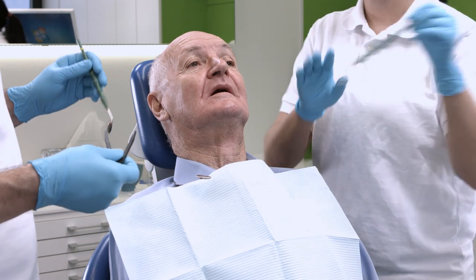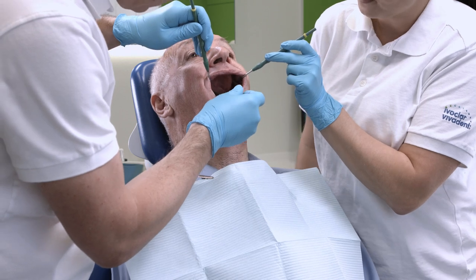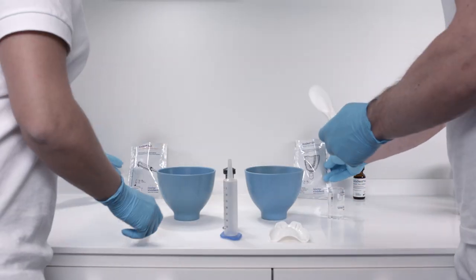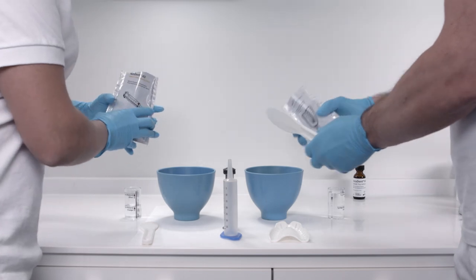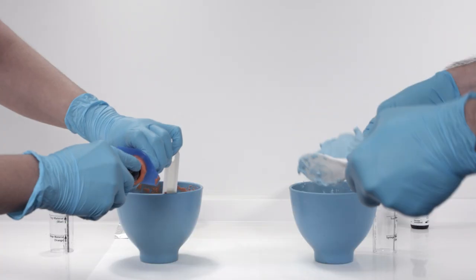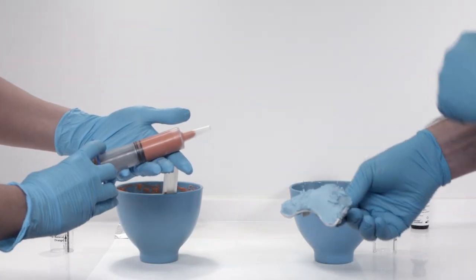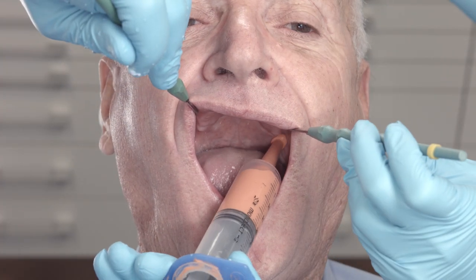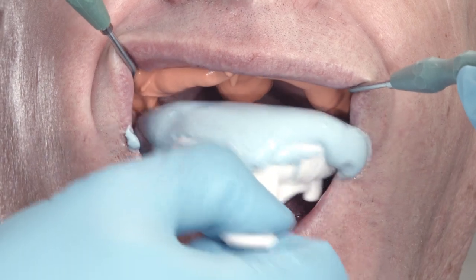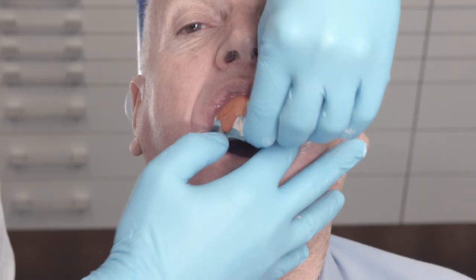Start the process by taking the initial impressions. Take the anatomical impressions of the upper and lower jaw in the usual way. Alginate and polyvinyl siloxane are suitable for this purpose. Mix and use the impression material according to the instructions of the manufacturer. The resulting impression should be void free and all the important anatomical details should be visible.